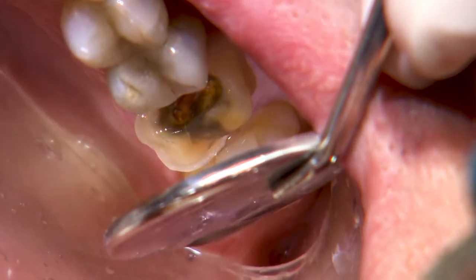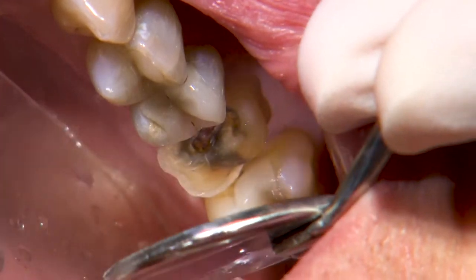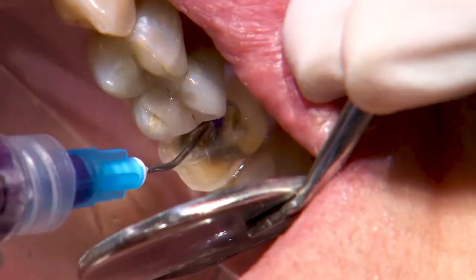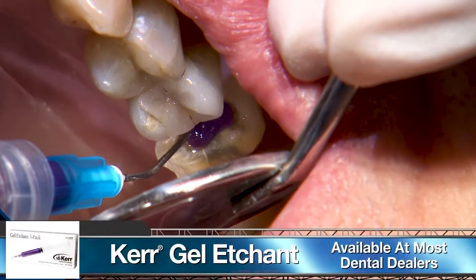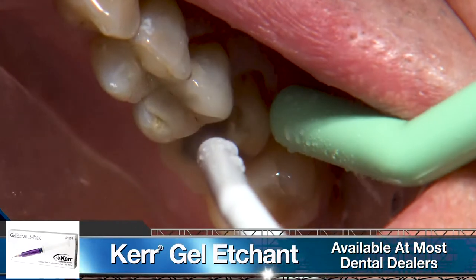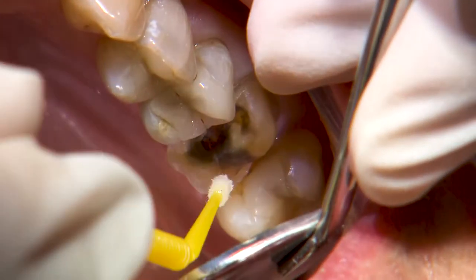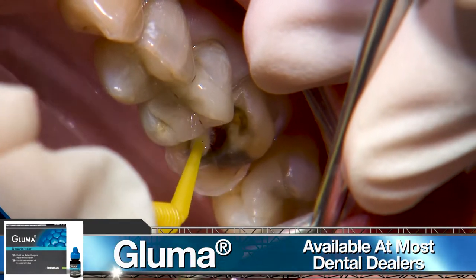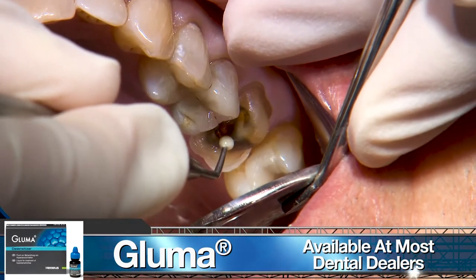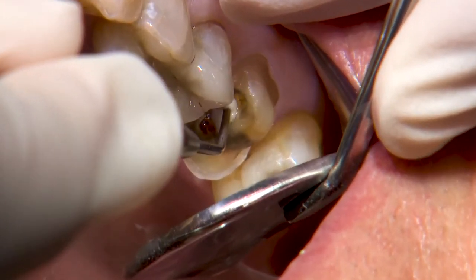On the mesial area, the translucent roof of the pulp chamber is visible. Since we're close, I'll place a thin layer of Vitrebond glass ionomer for added protection. Glass ionomer does chemically bond to tooth structure, but I like to do a quick acid rinse to remove the smear layer. I use 37% phosphoric acid for five seconds and rinse that off. I'll then place a one-minute application of Gluma desensitizer, suction off any excess, then apply the glass ionomer.